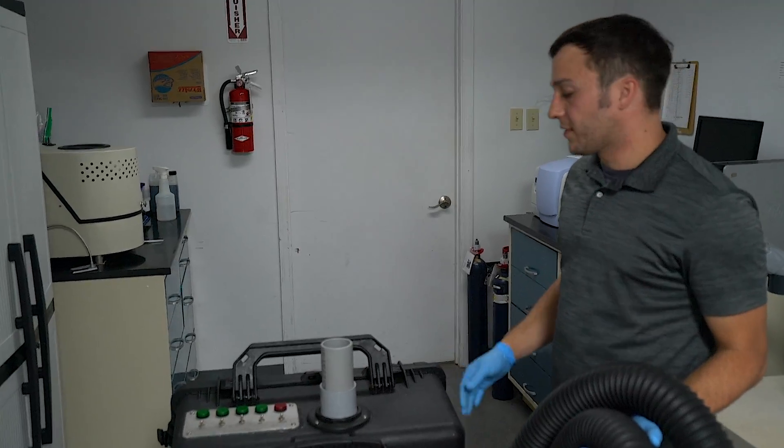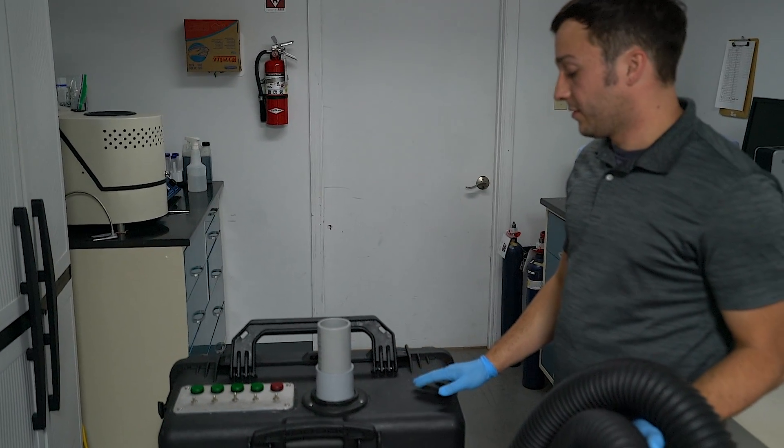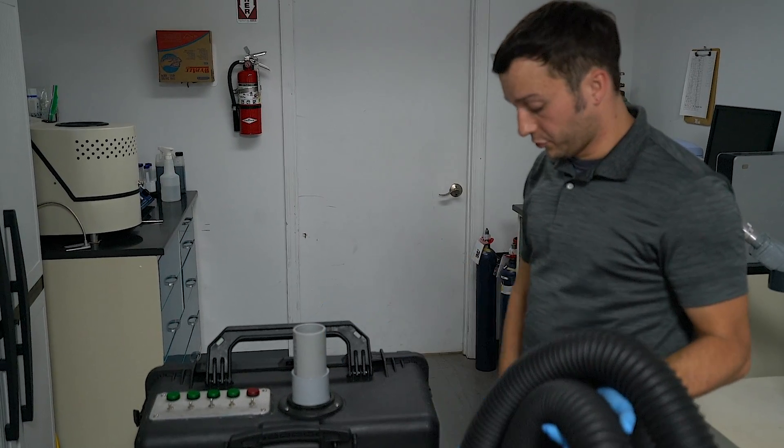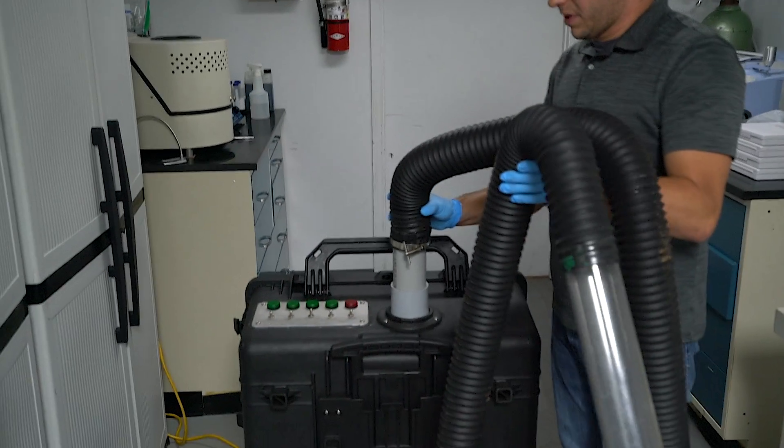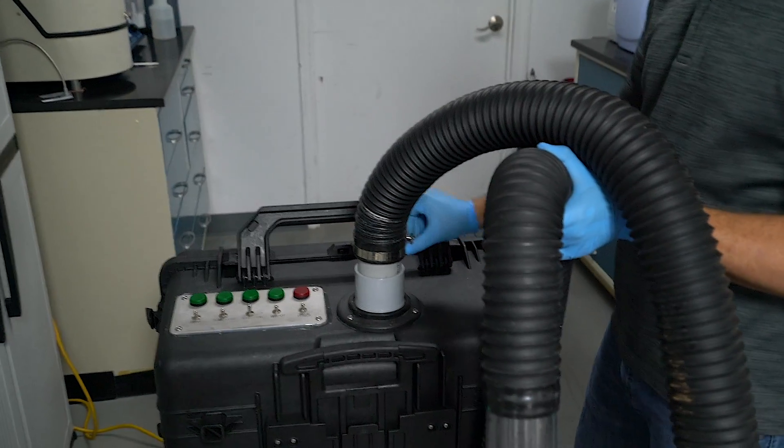This disinfection system can be utilized two ways. For room fogging applications, large areas, it can be used as is with no attachment. For direct fog applications, this hose can be attached by simply placing it on the exhaust port and turning the T-handle to the right.